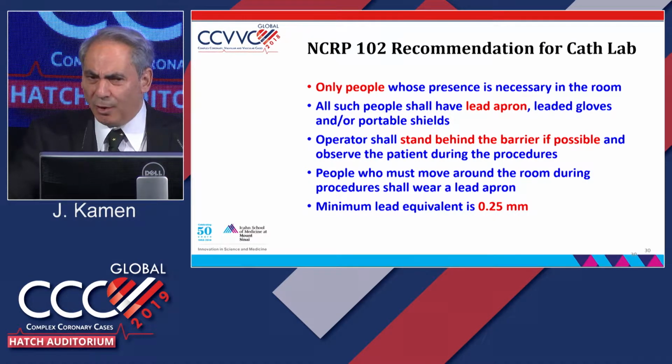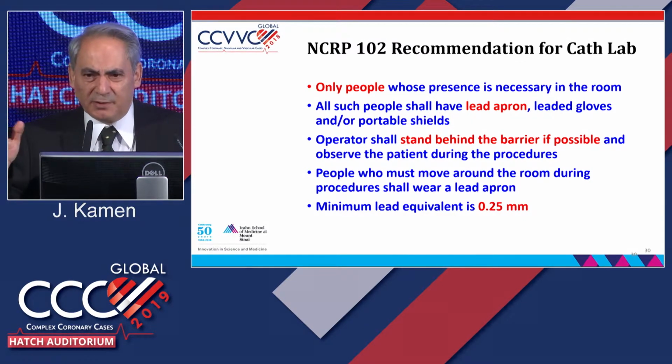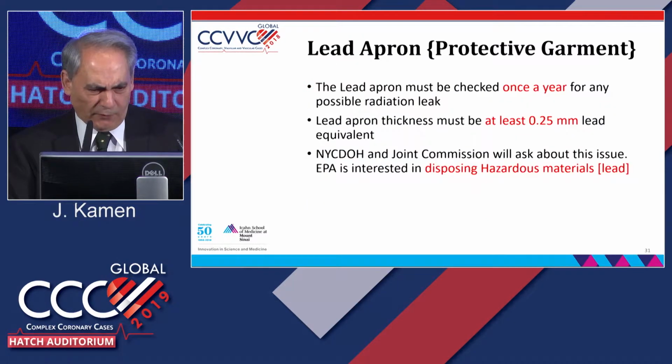Anybody knows why they call it lead equivalent? Is there anything out there that is not lead? Yes, there is. They call it composite material. It's 20 to 25% lighter than lead, but does give the same attenuation as lead. But if you fold it, it breaks. That's the drawback of it. So you could use any one you prefer.